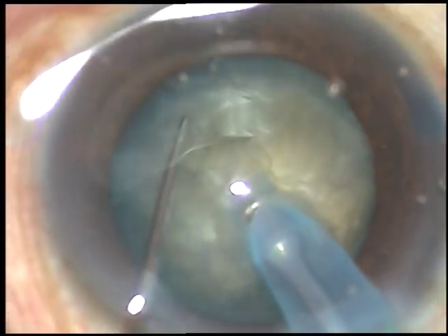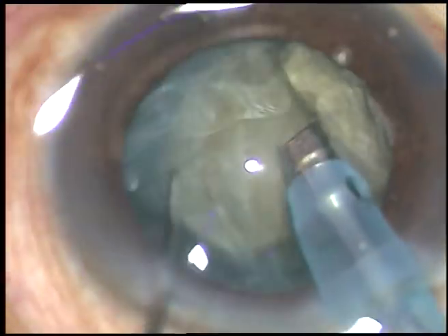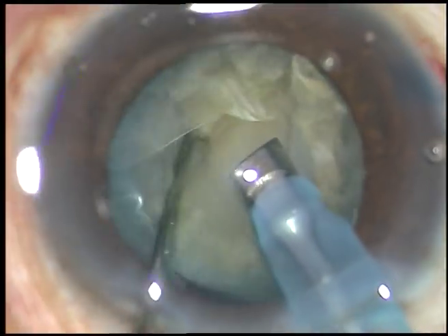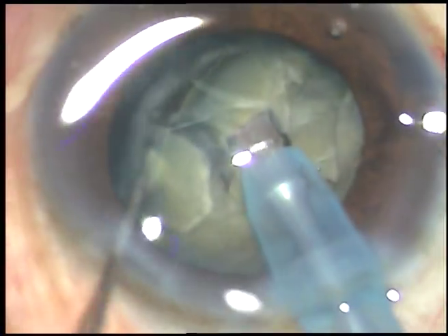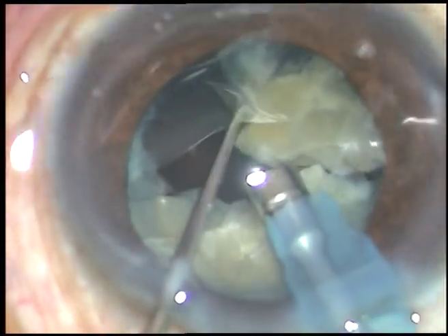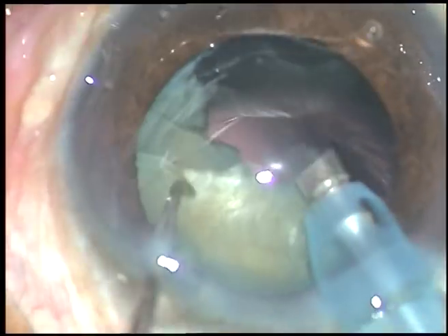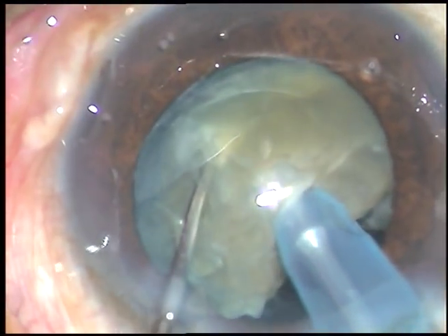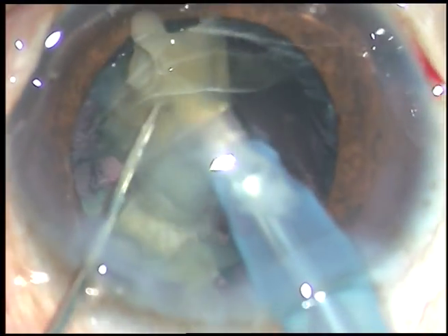Now this is what I call a submarine chop — go through the substance of the nucleus, and as I cross the center, I chop it. In this case the pupil has become a little small, but if this size of the pupil is maintained, it will not be difficult to manage this case. Now chopping and emulsification of the nuclear mass is in progress.